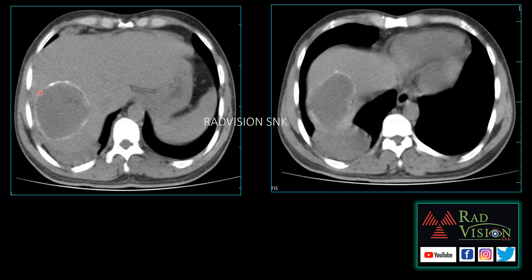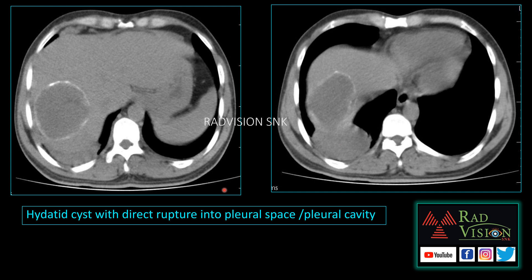On CT axial sections, you can clearly see this is the hydatid cyst, and there is a breach in the wall of the hydatid cyst with expulsion of the contents into the pleural space. This is a case of hydatid cyst with direct rupture into the pleural cavity. The most common location is the right lobe of the liver adjacent to the bare area, where the peritoneal covering is defective, so the hydatid cyst easily ruptures into the pleural cavity.